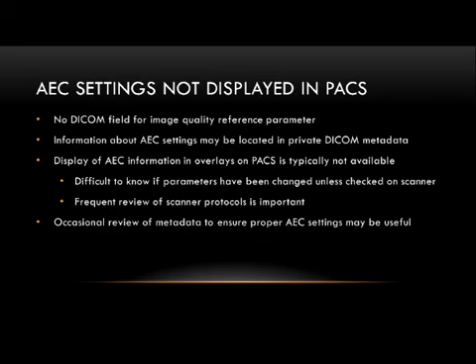So there's really no way that I know of, and I'd love to be corrected, on any system to pull in what noise index was actually used to scan a patient, or what the reference mAs was, or the mAs per slice. There's no way for the radiologist reading to know for sure that the protocol was actually followed unless they open up the data and the metadata and find the proper private field. I don't know of any PACS systems that do that. And so what that means is a lot of us could be flying blind to whether the right parameters are set for the tube current modulation.